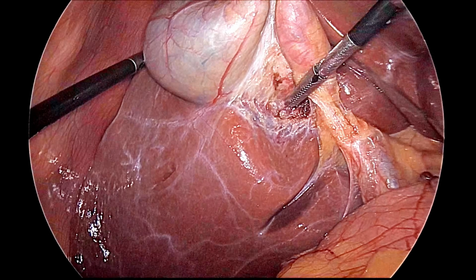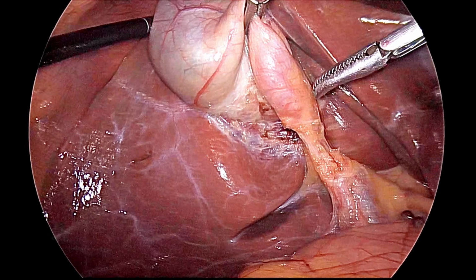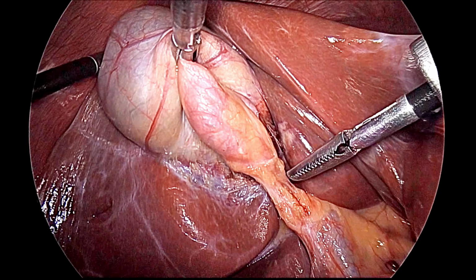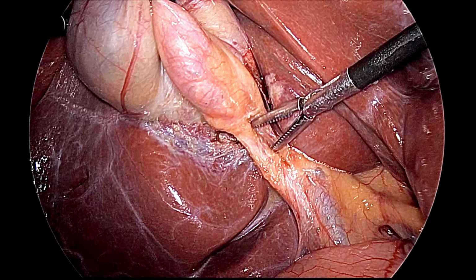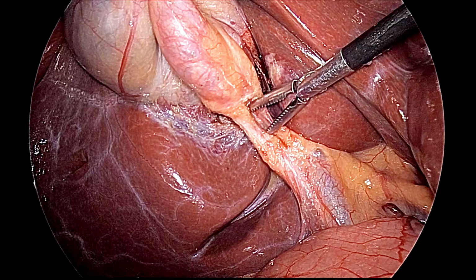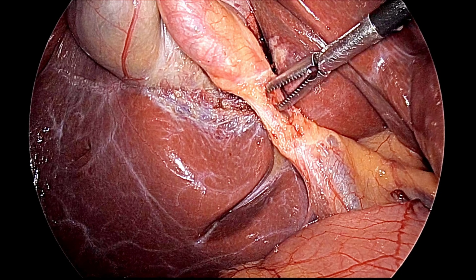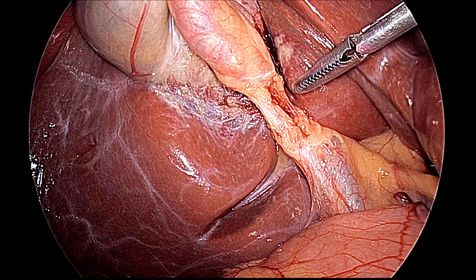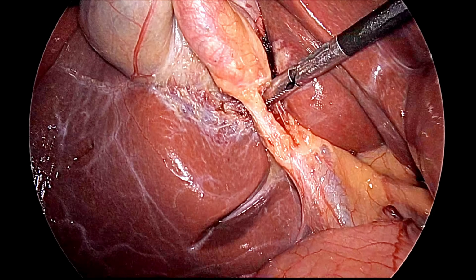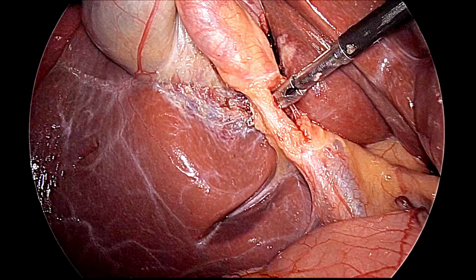After that, the posterior window is confirmed by opening the jaw of the Maryland, and we can see the inferior surface of the liver is visible. After that, you can open the Maryland in the direction of the tubular structure. Always the Maryland tip should be opened in the plane of the tubular structure. We should not open it at a right angle. And after that, we will hook the duct by turning the Maryland, and this is the anterior window formed.